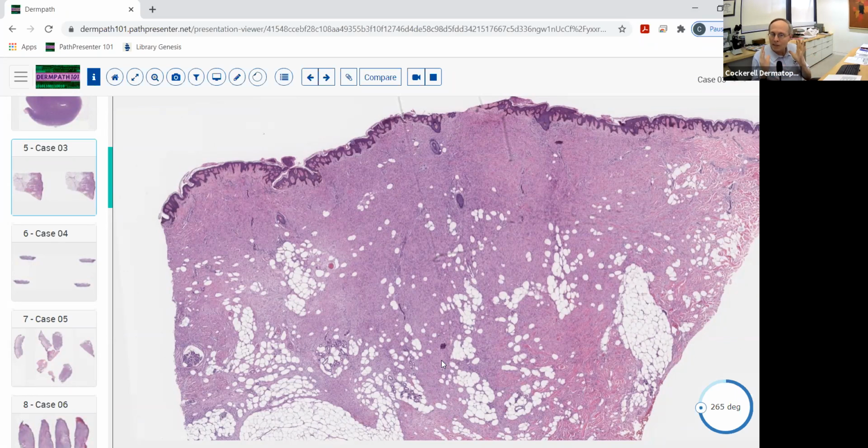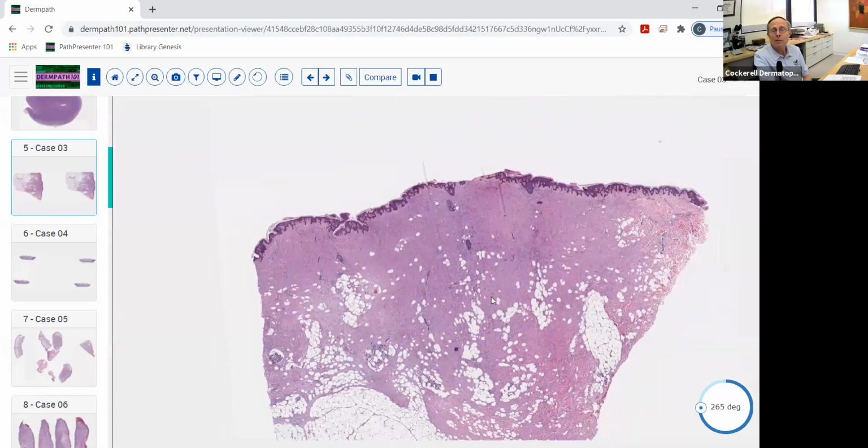It's not this very dense, dark, diffuse staining pattern that you get with CD34 when you're staining DFSP. So again, the main differential diagnosis you're going to have is between a neural neoplasm and this, not a dermatofibroma. And of course, the stain for a dermatofibroma is a factor 13A stain, which is strongly positive in that lesion. So, nice example of DFSP.